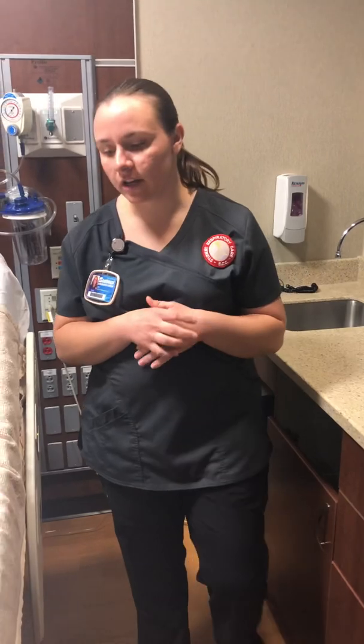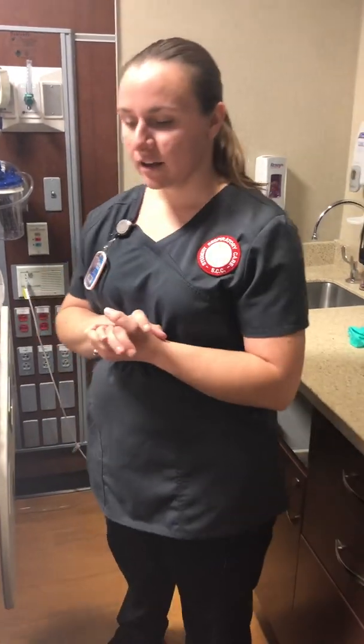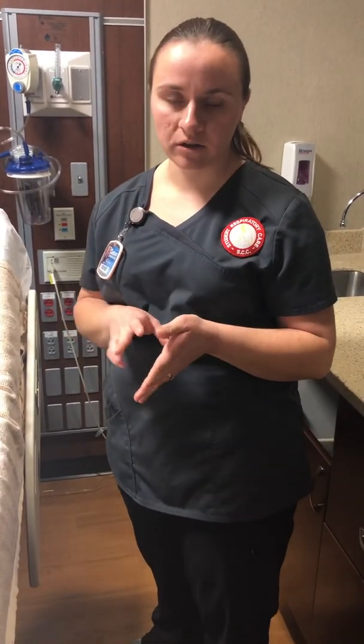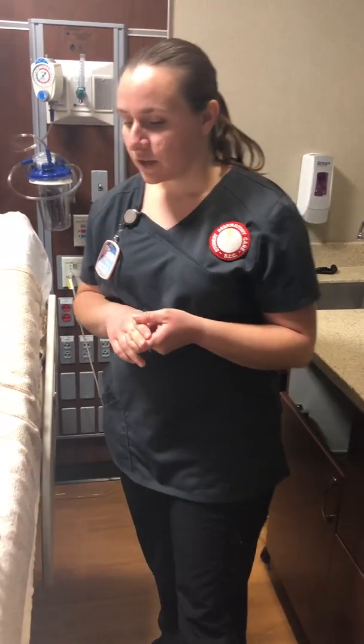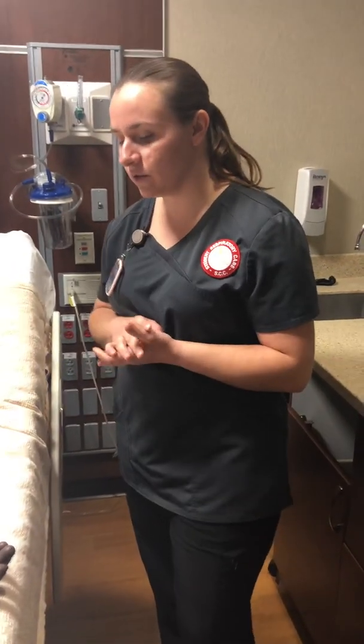Once I am ready, I always knock on the patient's door and introduce myself. Hi, my name is Amy. I'm a respiratory care student with the respiratory care department. Before I draw the blood, I always need to make sure they are the correct patient. I check their ID band for their name and date of birth.